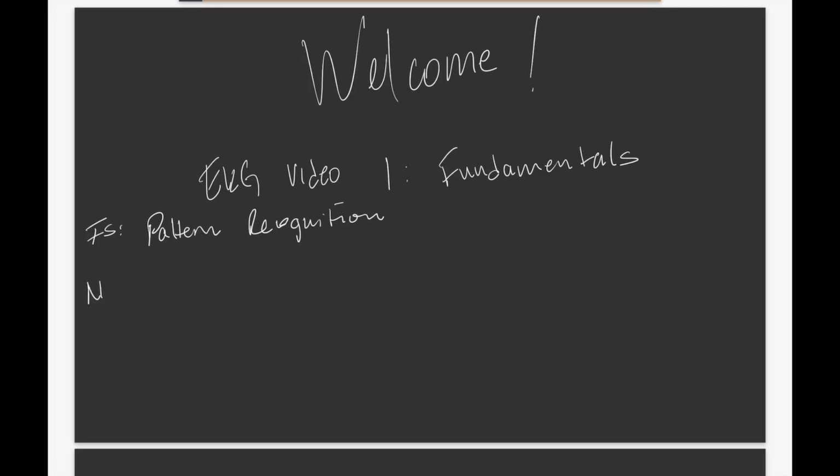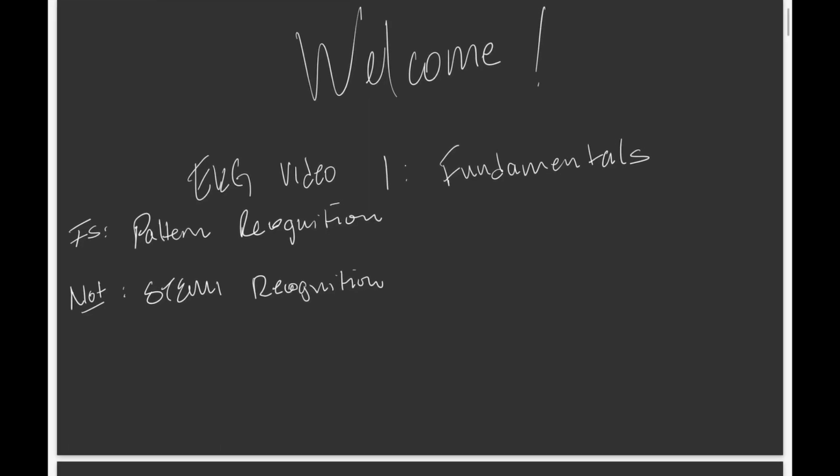What this video is not, and what this video series is not, is strictly a STEMI recognition video series. There are many more things that occur on 12 leads that we need to be aware of besides STEMIs. Okay?